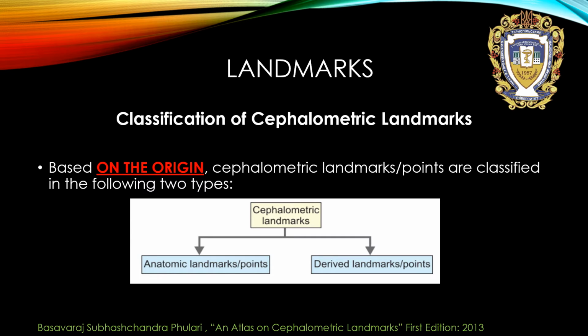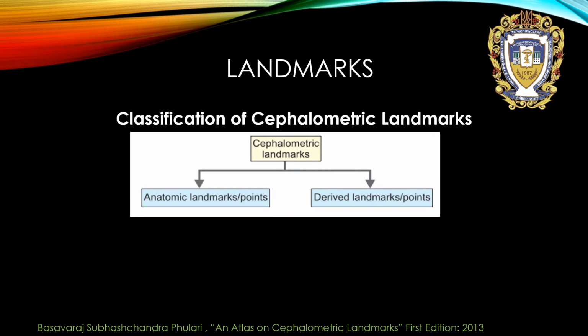What does it mean? Anatomic landmarks and points: these landmarks represent the actual anatomic structures of the skull.